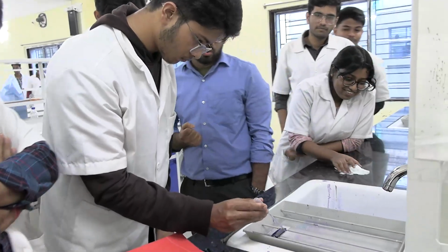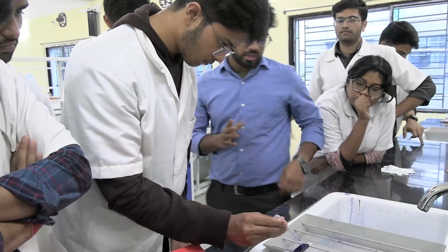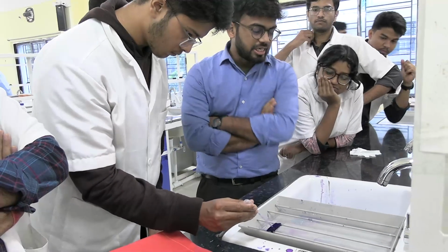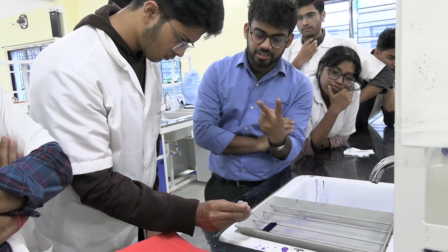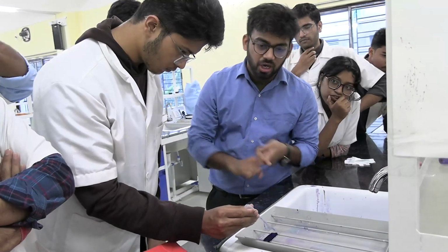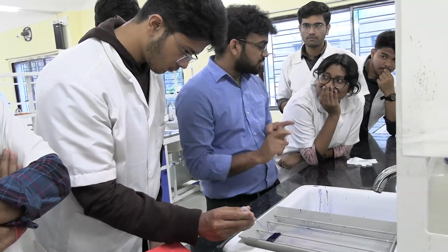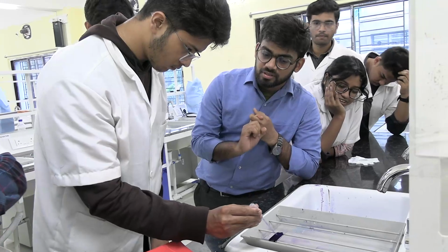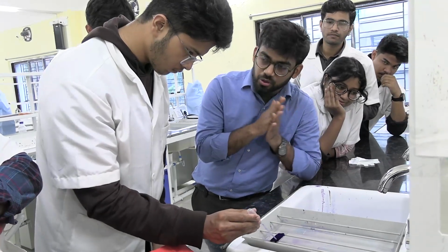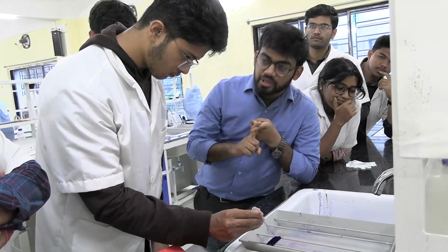So, why is it acetone-free? You all know the function of methyl alcohol. Now, Leishman stain belongs to the Romanovsky group of stains. It has two components: an acidic component and a basic component. What is the basic component here? Methylene blue. What is the acidic component?